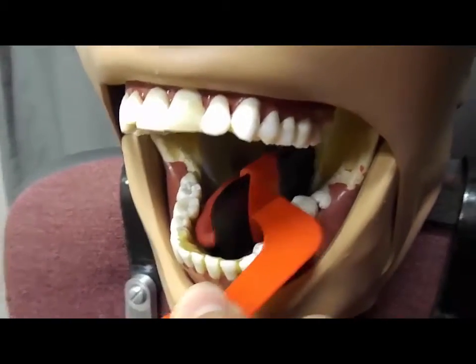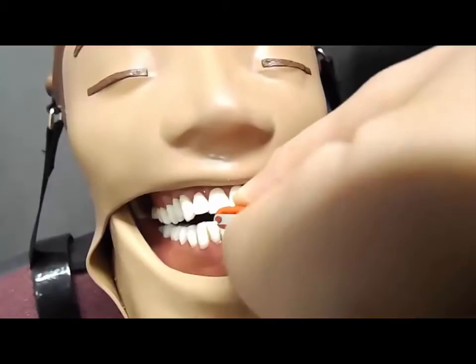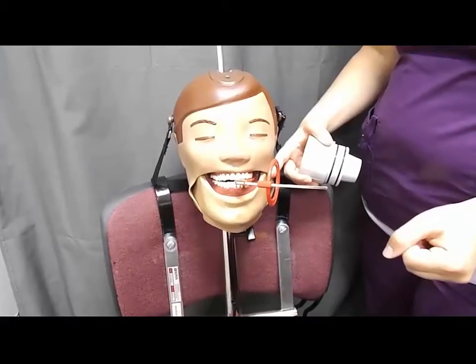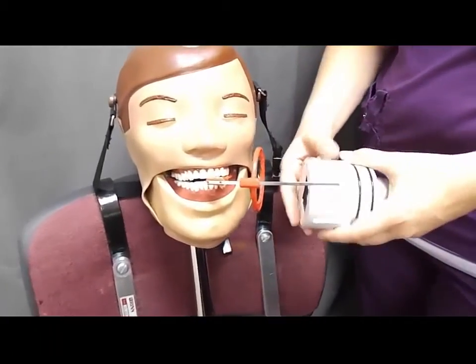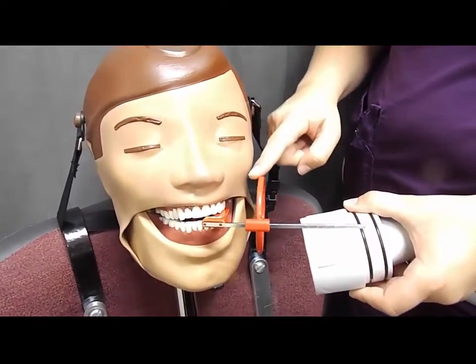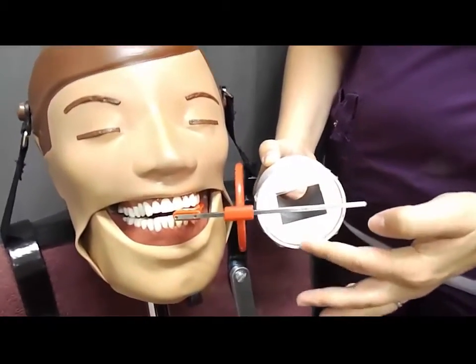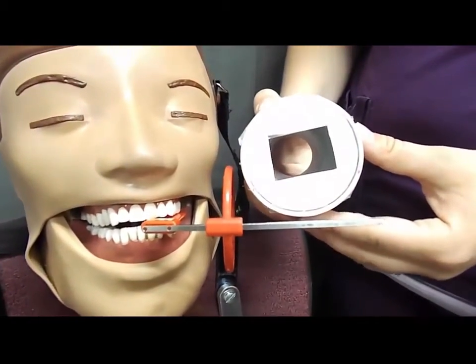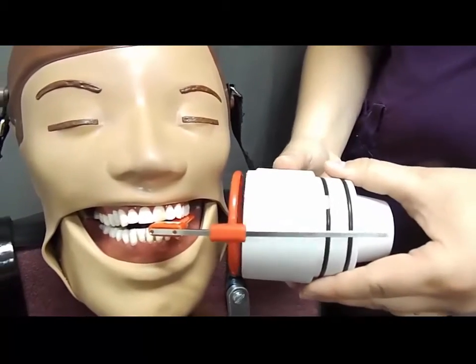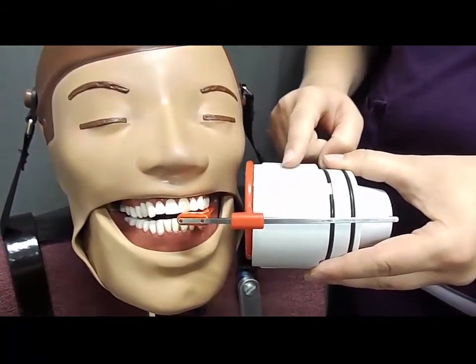When placing a premolar bite wing, make sure you bring it as far forward as you can so the front edge of the sensor hits the front of the patient's mouth, and have the patient close. You're going to slide the ring forward so it's about an inch from the patient's face — never up against their face — and turn the end of your tube so that the orientation of the collimator matches the orientation of your phosphor plate, and that the tube is flush with the ring and your notches are aligned.